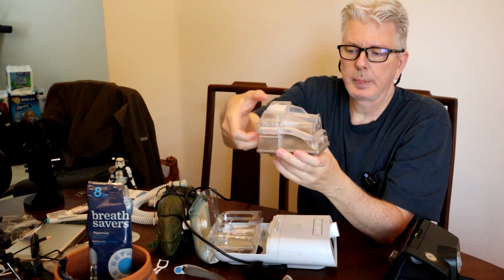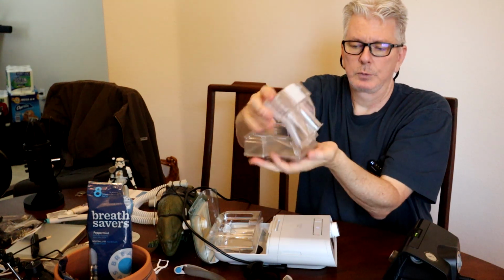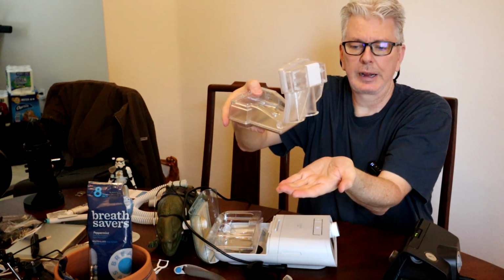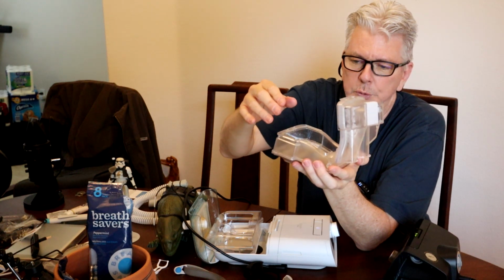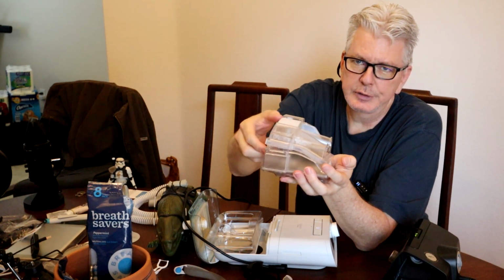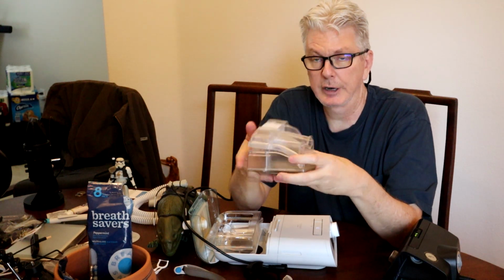One drawback to that is when you take it out of the machine and you unlatch it and open it up, if there's any condensation in these holes, what I always do is I open it up like that, and then the condensation kind of comes out on my hand, and so you're just like, ugh, okay. I mean, it's not terrible. It's just kind of a fact of life. It's just the way things work. So not every single day, but at least every third day or so, I open it up, and the condensation drips onto my hand, and you just have to kind of remember that that's going to happen.